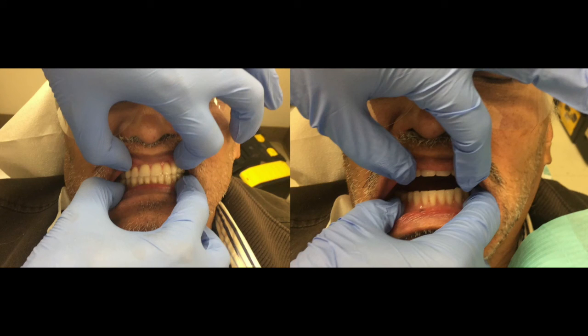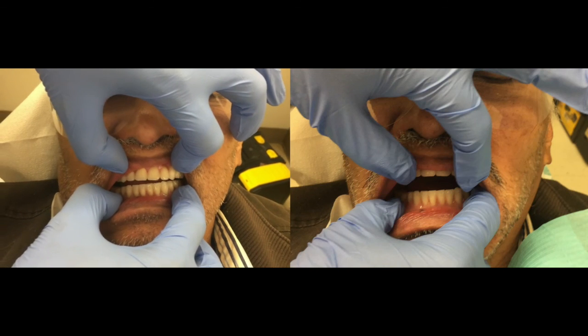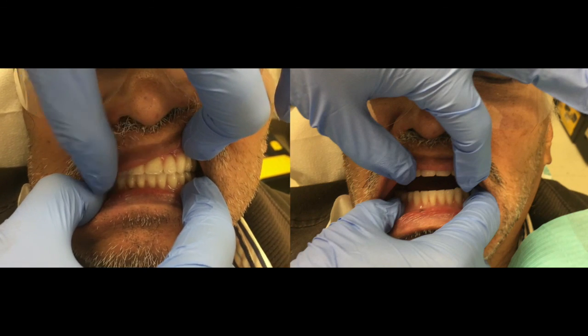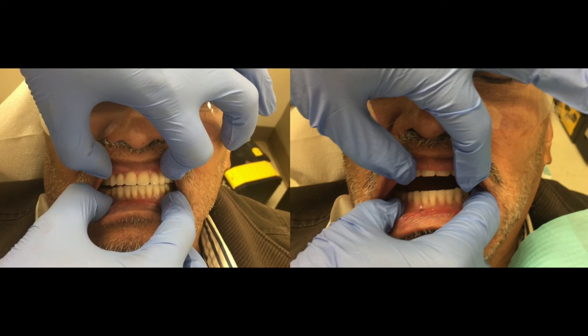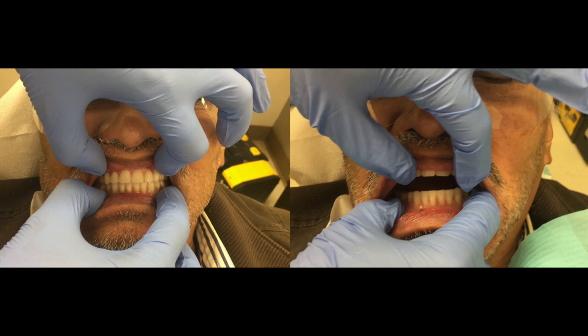Let's take a look at another case one more time. Close slowly. Close. All right. How many of you recognize any occlusion error?